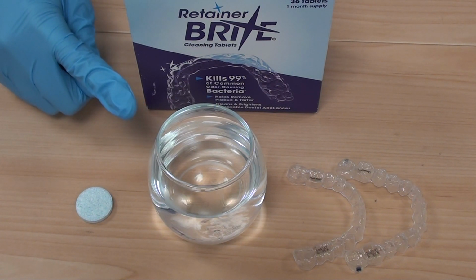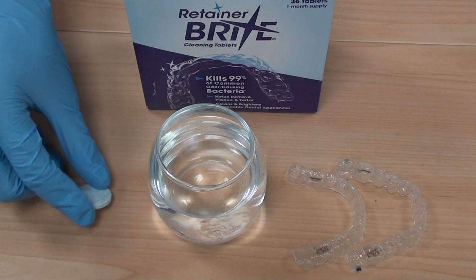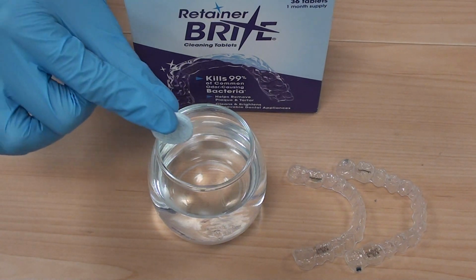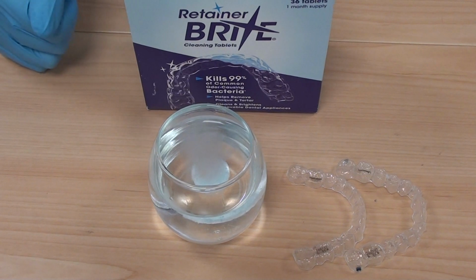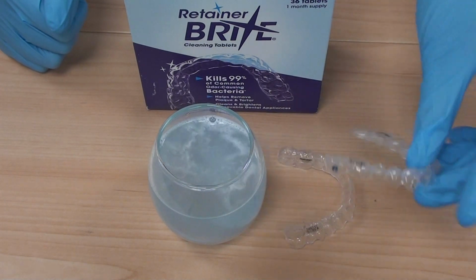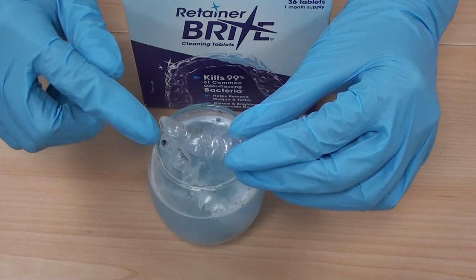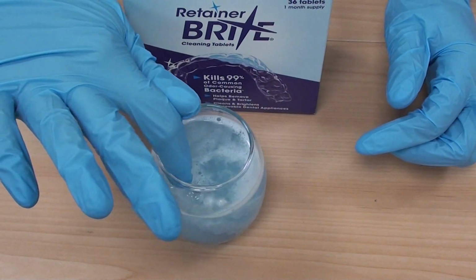Ensure it is not hot, it needs to be lukewarm. Place 1 tablet of Retainer Brite into the solution. While the tablet is bubbling away there, place your aligners into the solution. Ensure the retainers are covered.